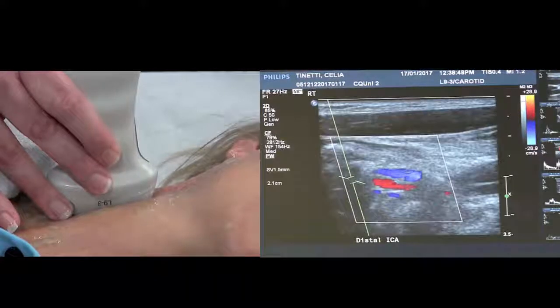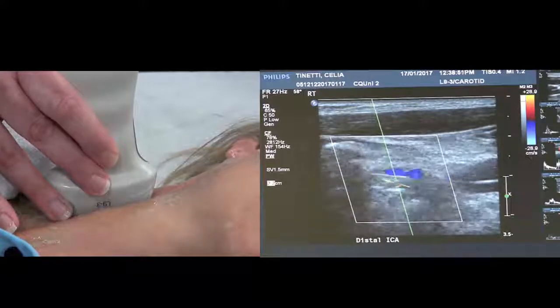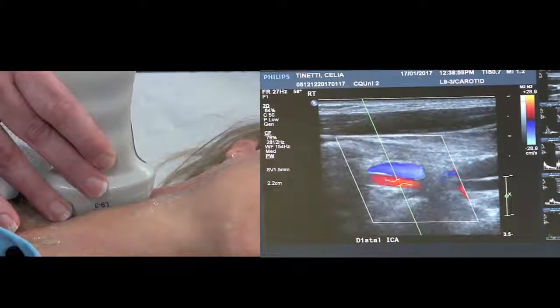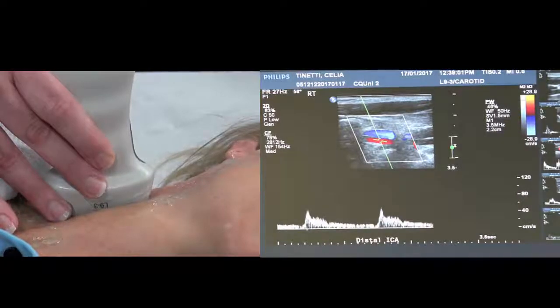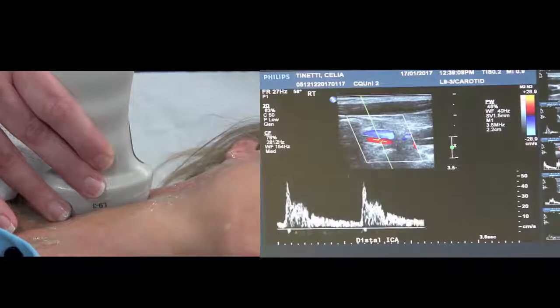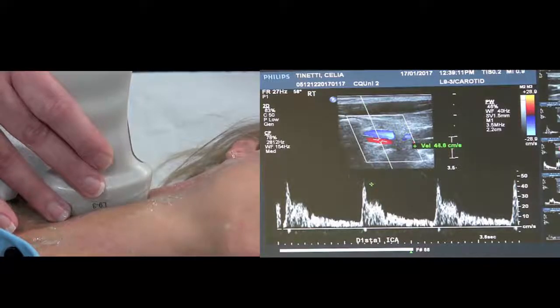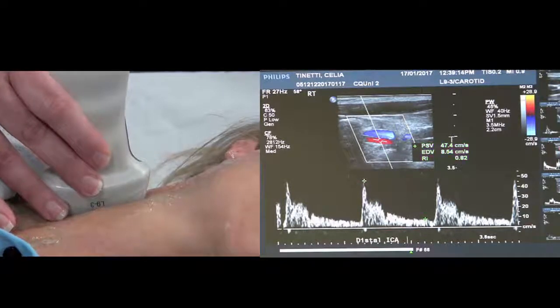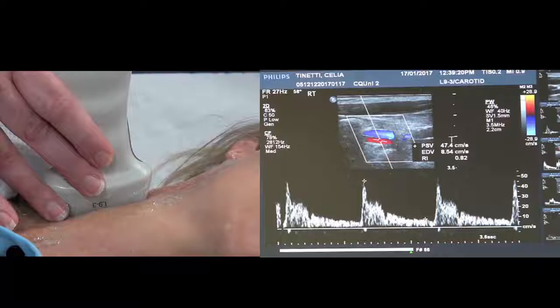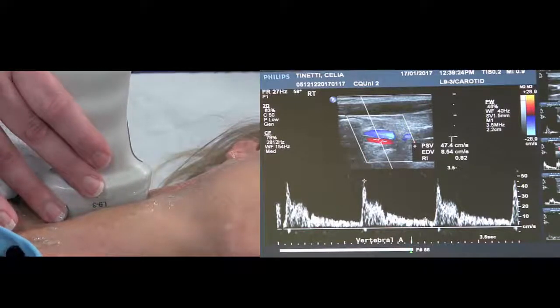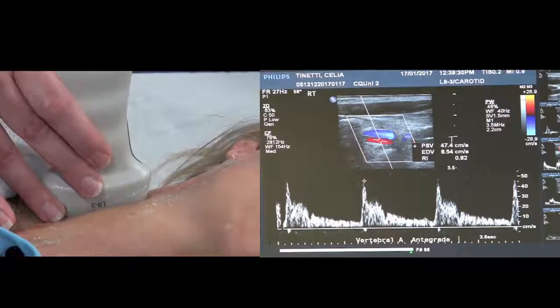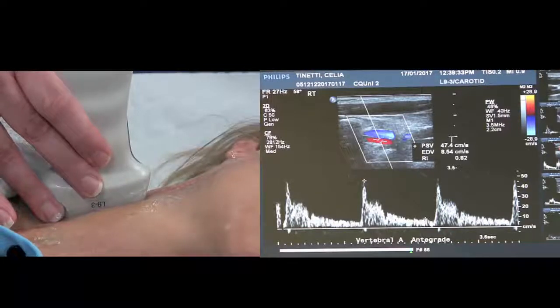Now that's a nice trace. We're just going to pop the trace in here — very fiddly. You're going to get hand cramps when you're first learning to try to get used to doing this, so please persist with it — it does come, you do get it eventually. Now that trace is very small so we're going to change the scale. You can hear the sound — it's very different. There's vertebral — vertebral artery. Now is it antegrade or retrograde? We've already checked with the CCA, so if you label that, that would be great.